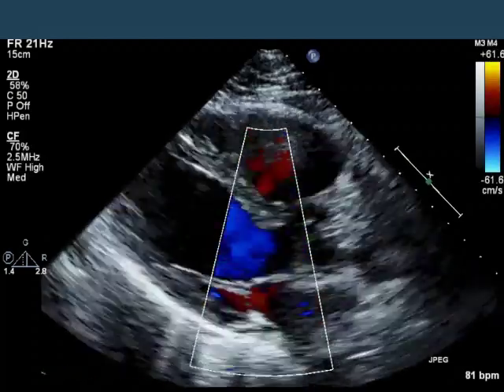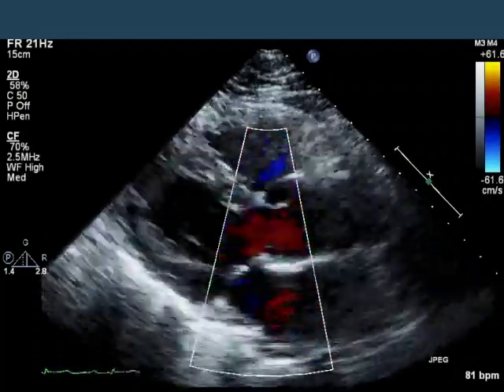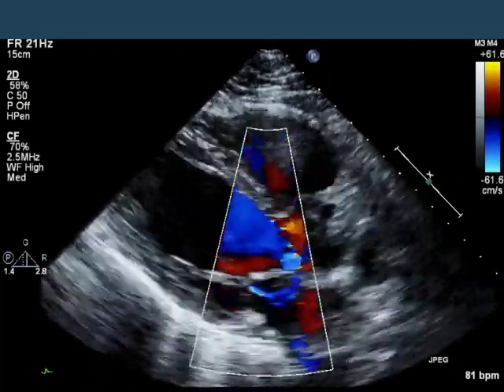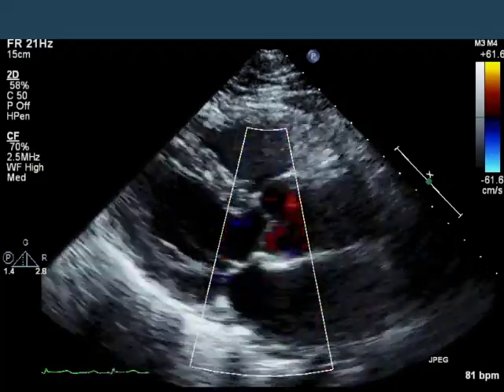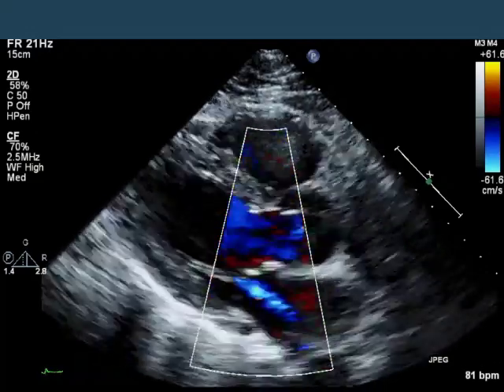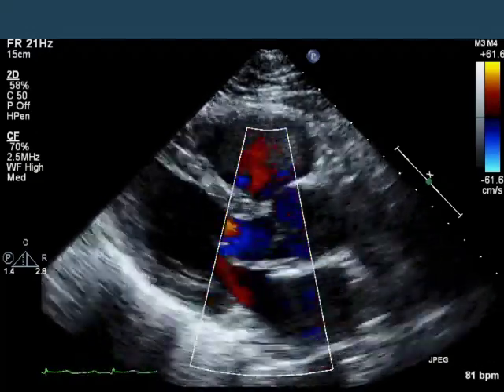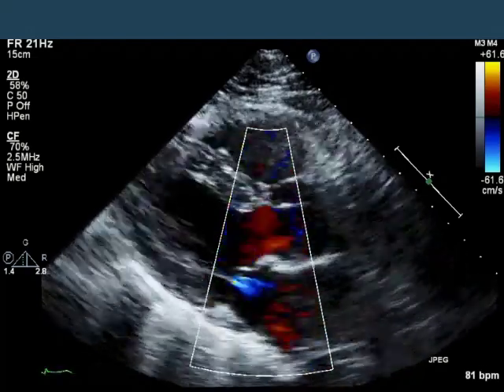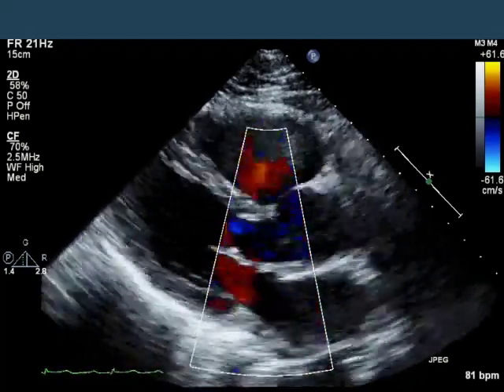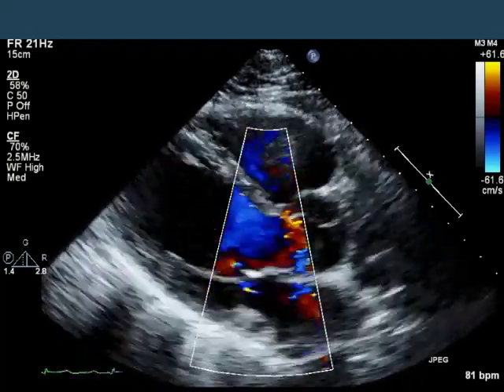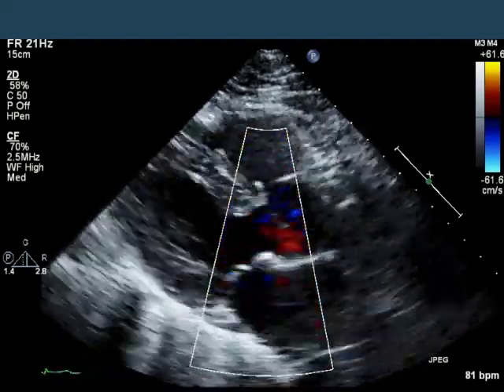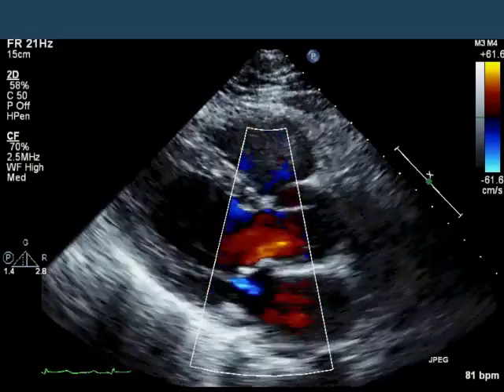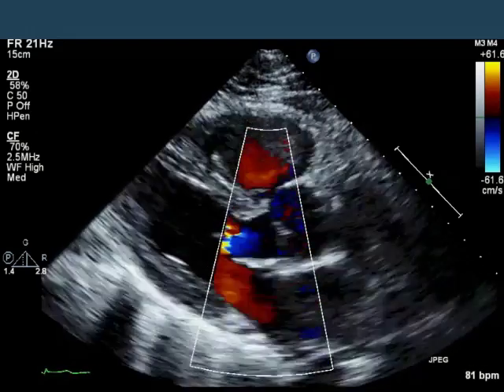This is the parasternal long axis now with color, demonstrating that the aortic valve appears to have neither stenosis nor regurgitation, and there's at most mild central mitral regurgitation. Nothing particularly exciting here.